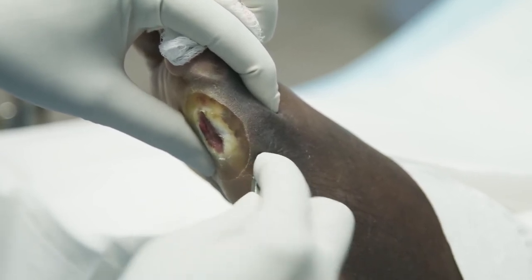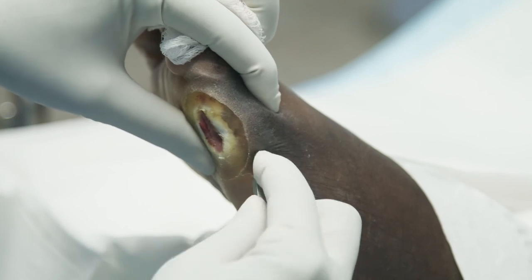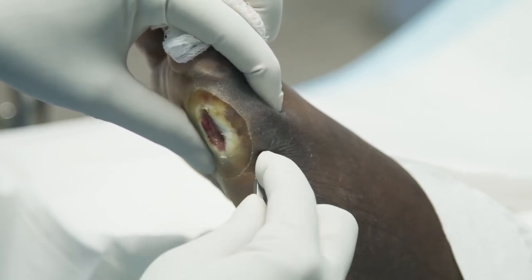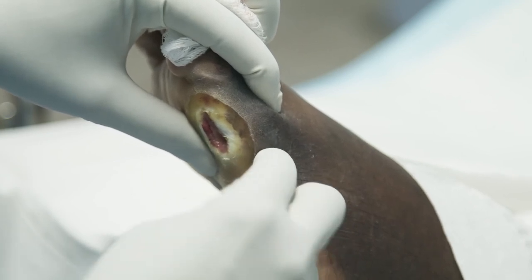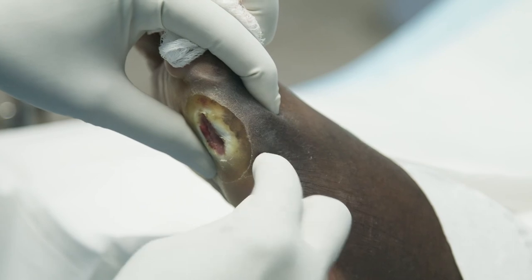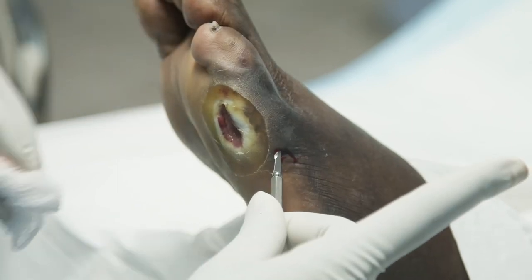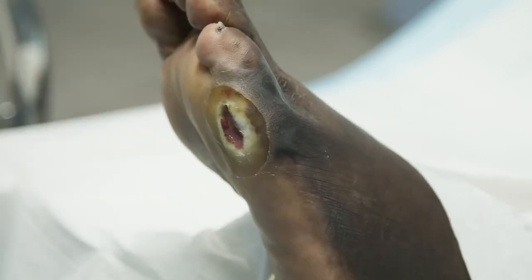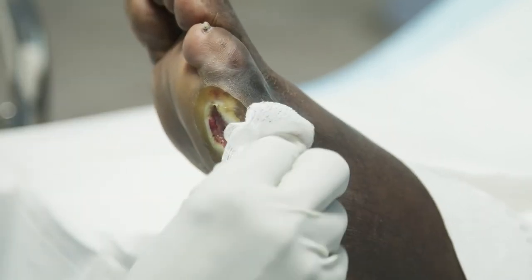Now the joints of the human body are like coconuts. You picture a coconut, it has a capsule inside, right? Hear that? So I'm in the coconut, appendage going past one part into the other. Okay, that's the size of the blade. That's the size of the wound. Now Felicia's gonna line me up with my burr.